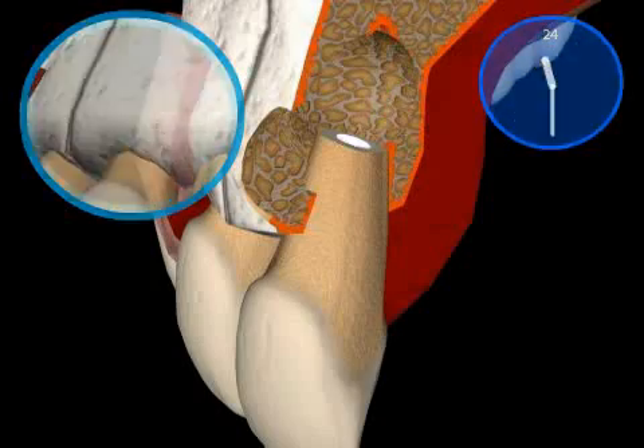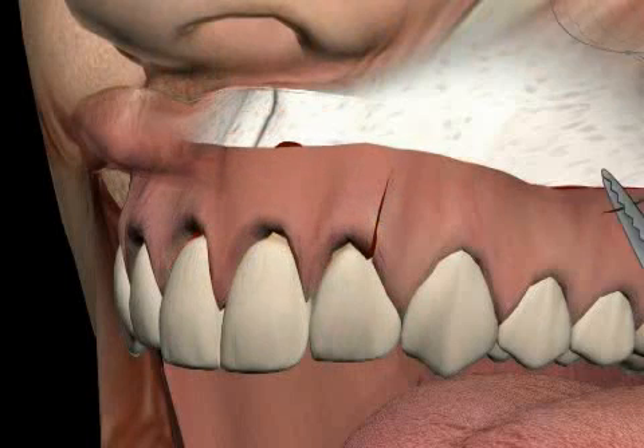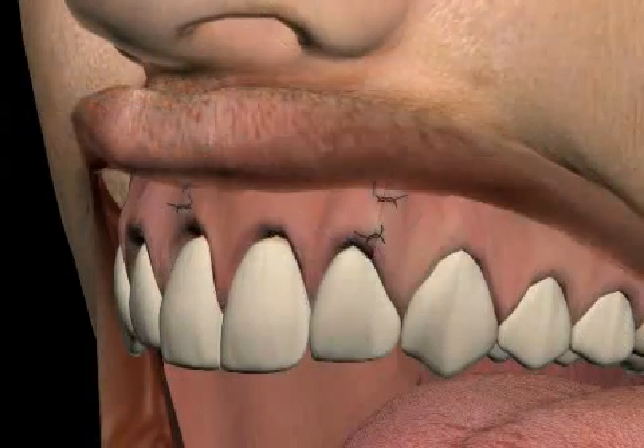The root is now sealed tightly. In about a year, new bone should form around the root tip. This process is monitored with x-rays. Lastly, the wound is sutured. This procedure is root tip resection with retrograde filling.